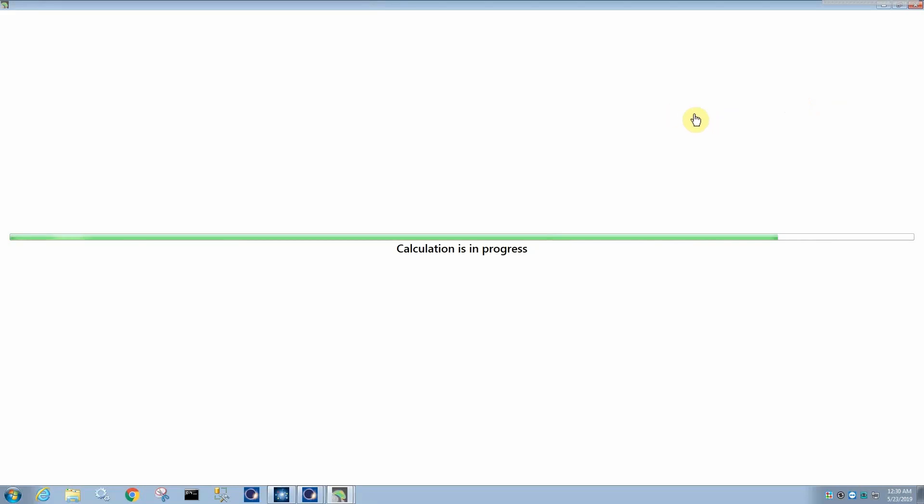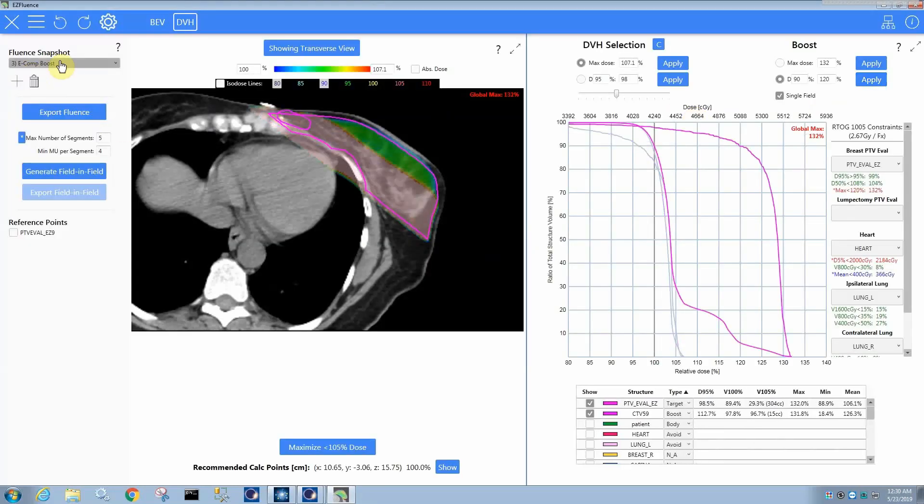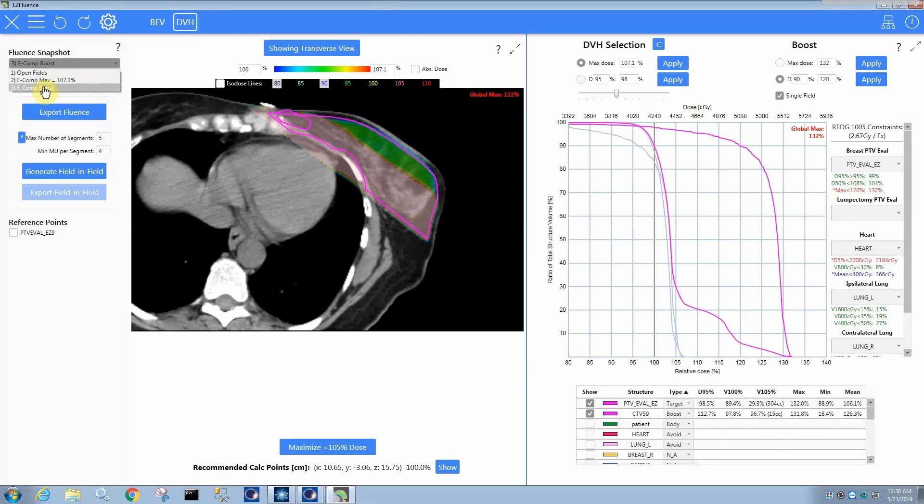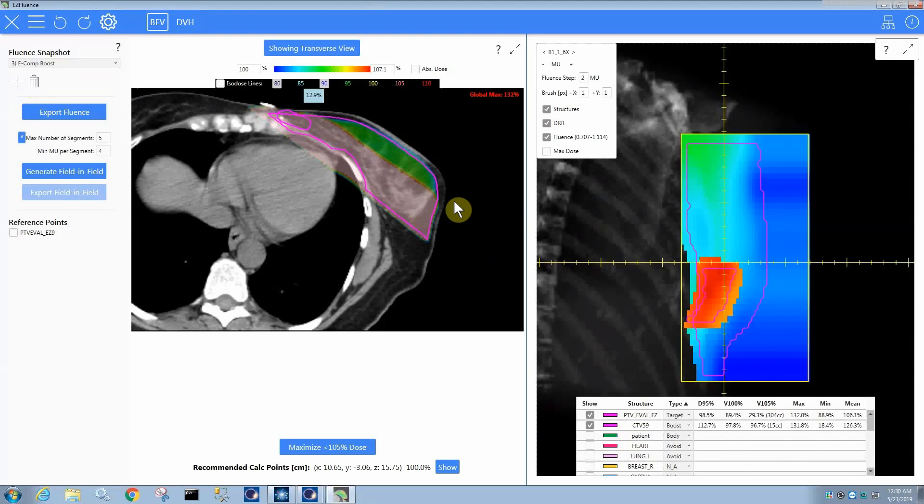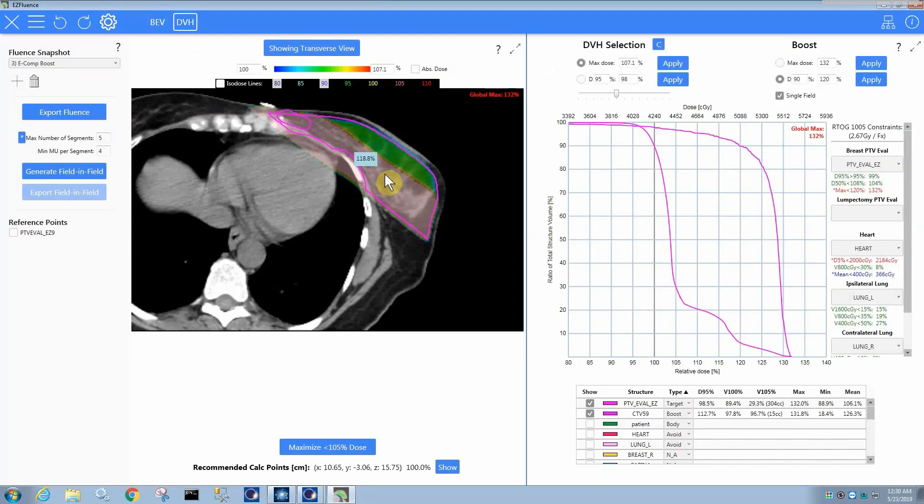So currently, since I had an e-comp snapshot selected, you can see here, this was my snapshot, it does an e-comp boost. So an e-comp boost, you can see, has the effect of increasing the fluence, specifically the fluence pixels that contribute a reasonable amount of dose to the target. So that is how the e-comp boost works.